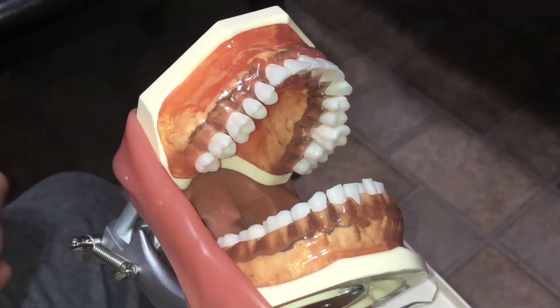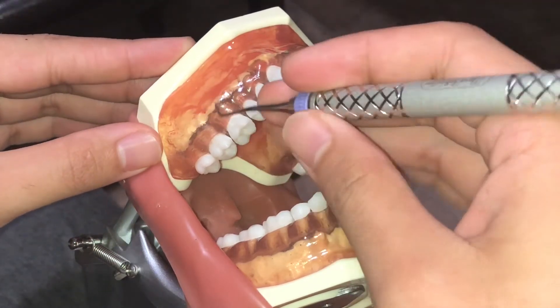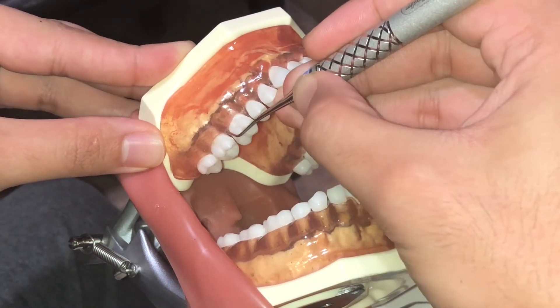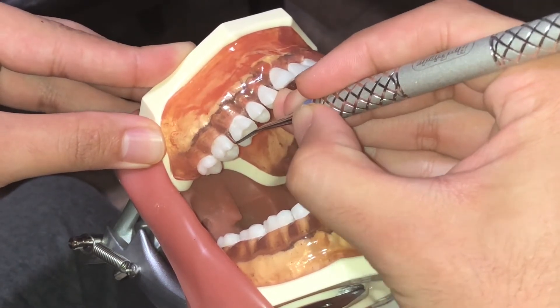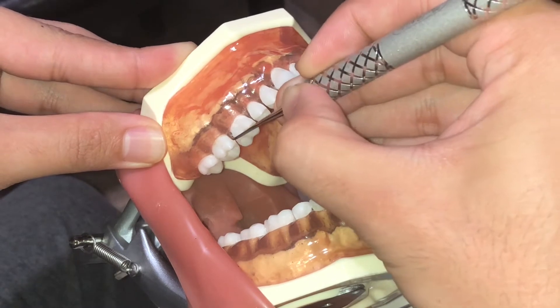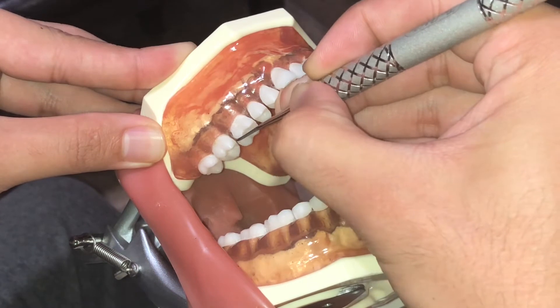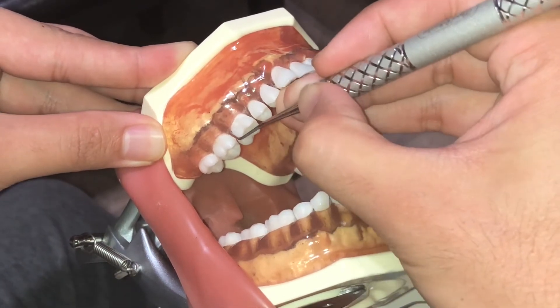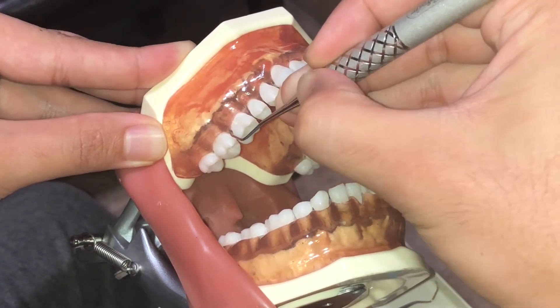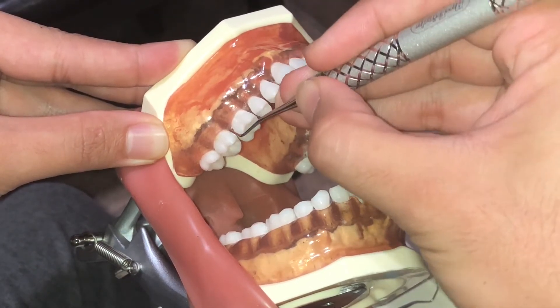Next, I'll be instrumenting the buccal aspect of number three using a universal Barnhart 56. First, I place my fulcrum, then start with a closed blade insert, and activate. Then reinsert on the distal line angle, angulate, and activate.